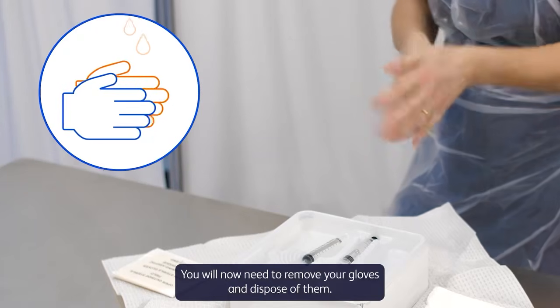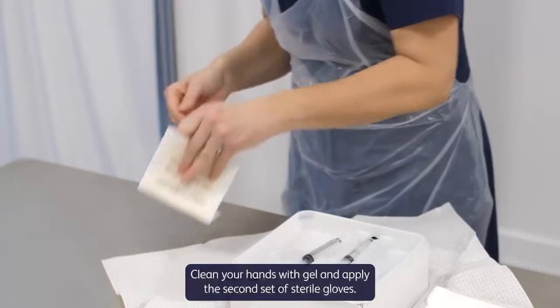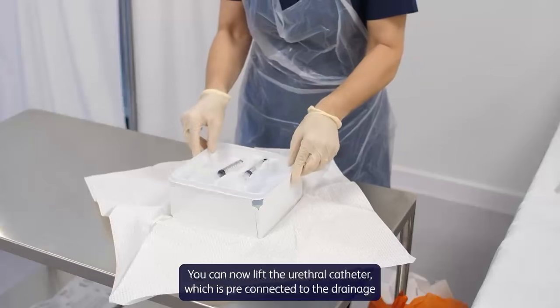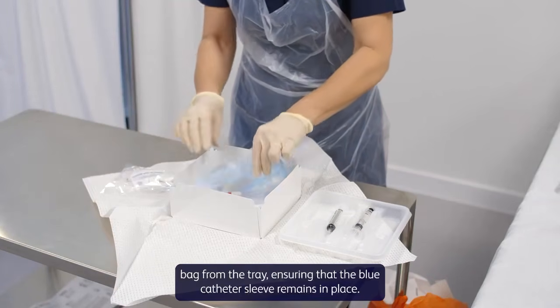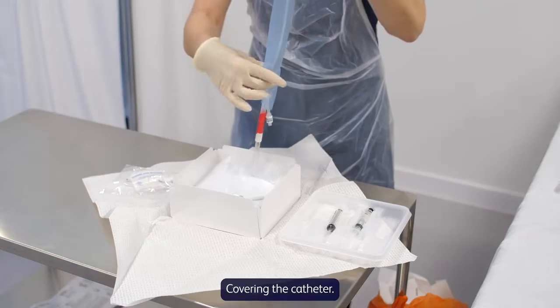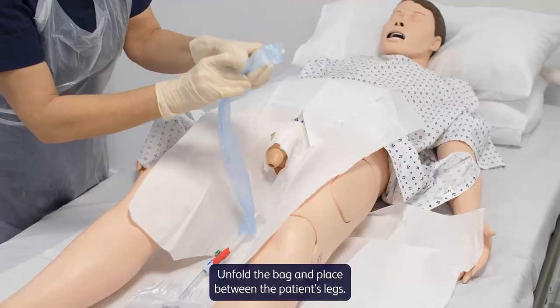You will now need to remove your gloves and dispose of them. Clean your hands with gel and apply the second set of sterile gloves. You can now lift the urethral catheter, which is pre-connected to the drainage bag, from the tray, ensuring that the blue catheter sleeve remains in place, covering the catheter. Unfold the bag and place between the patient's legs.